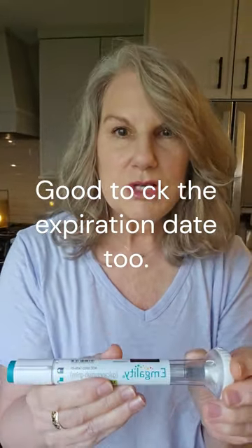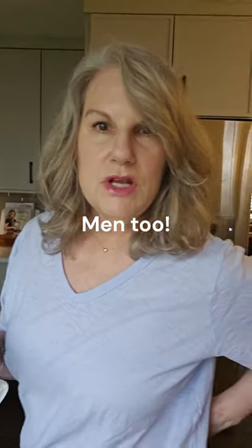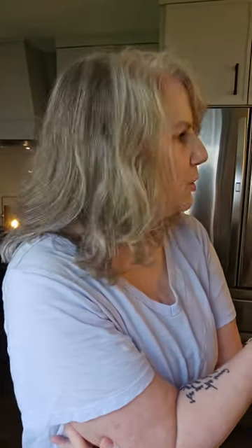You give it subcutaneous. So a lot of ladies give it here in the tummy, or I've watched some where they give it here. They say they give it in their love handles when they have to do it by themselves. My choice would be here, but my husband is going to give it back here. So this is kind of like when you're getting an injection or giving yourself an injection for diabetes.